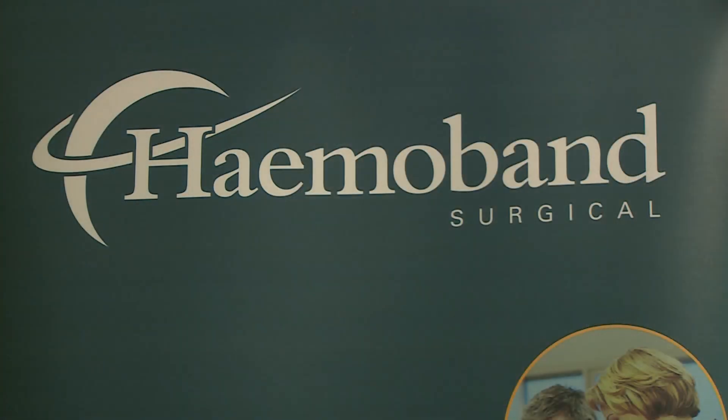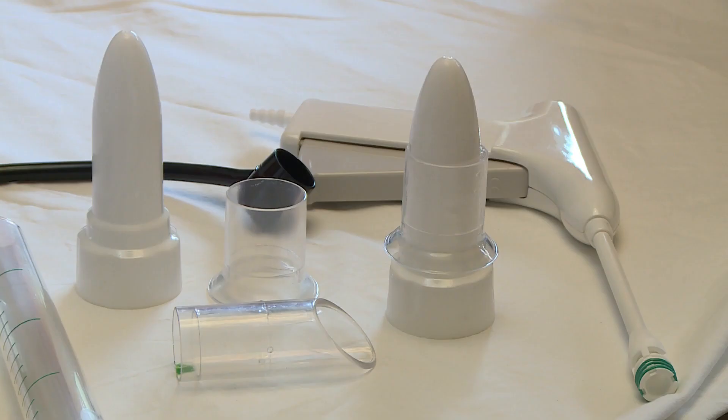In this video, Hemoband Surgical would like to present a new system for the examination of the anal canal and rectum. This also facilitates applying bands on hemorrhoids. It's called a system because it integrates the instruments used — the rigid sigmoidoscope and the proctoscope — in a unique, innovative way.